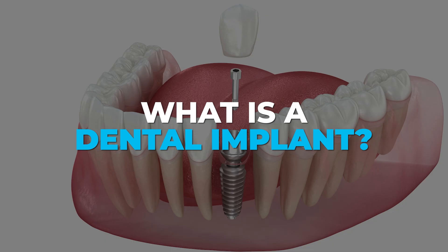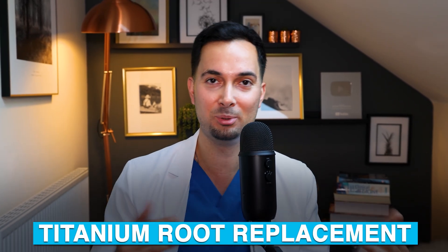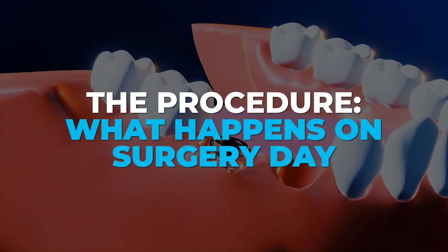A dental implant is basically a titanium screw that replaces the root of a missing tooth. Once this screw heals it's acting like a root and then a crown is attached on the top, so it looks and functions like a natural tooth. They're safe, they're long-lasting and they can restore your smile and bite confidence. So let's now talk about the procedure — what happens on the day.